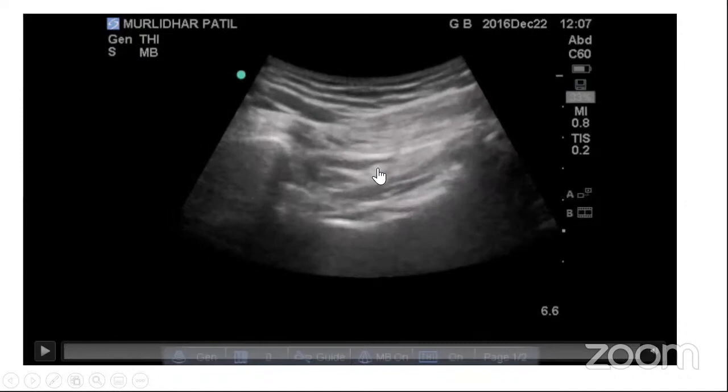So you mentioned the subgluteal space. That's not the subgluteal space. That's the local anesthetic which has gone in. I don't remember seeing the subgluteal space many times. I don't know the incidence. I have not seen any articles regarding that. But as Sandeep has mentioned, let's see about that deep gluteal space.